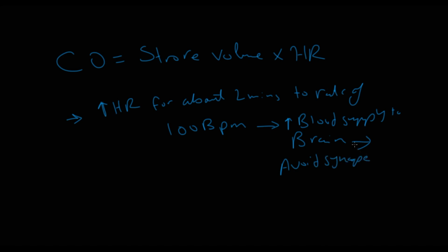The pacemaker of choice in these cases is usually a dual chamber pacemaker. So again, this is the heart, and we're going to insert the atrial and the ventricular leads. The atrial lead is important to get information of when a syncope is about to happen.